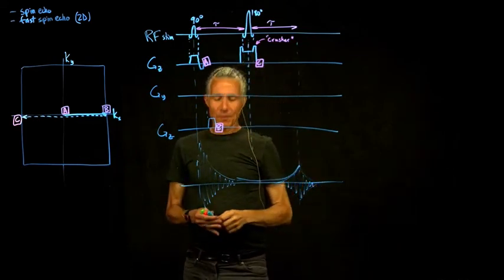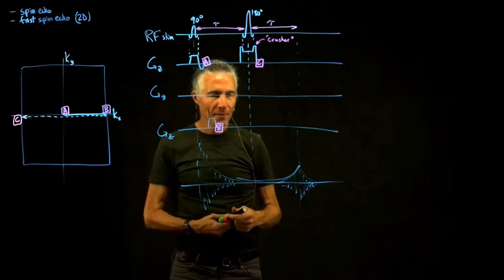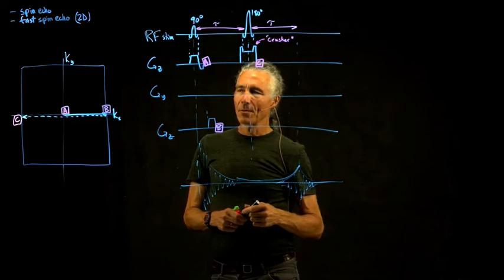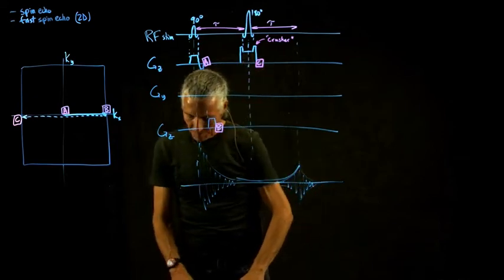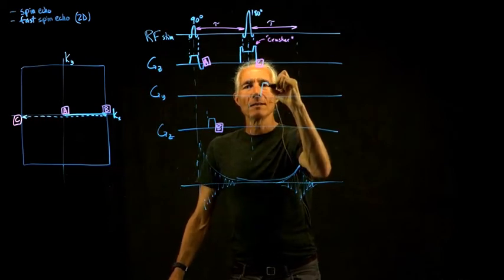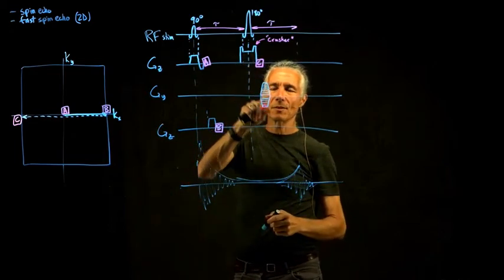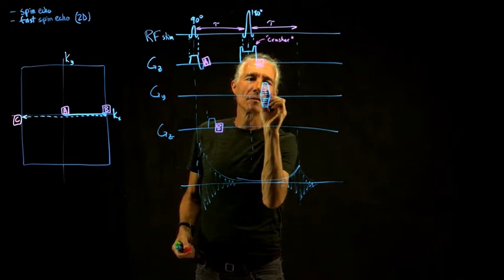Okay, so now we're over here. Now we have to collect a line of K-space, and for that we need our phase encoding step. The definition of phase encoding is simply that you turn on the gradient before you do the readout. We'll put the phase encoding step over here in the y direction. That means you have to repeat this whole sequence a bunch of times, setting the phase encode gradient to all those different points. Let's assume we set the phase encode gradient to, say, halfway up.